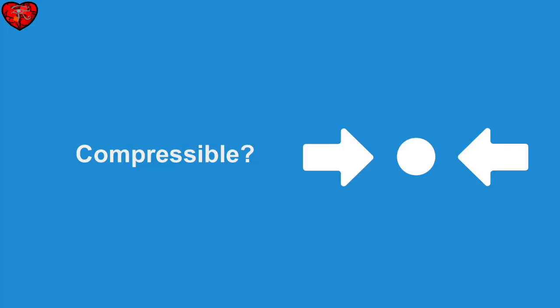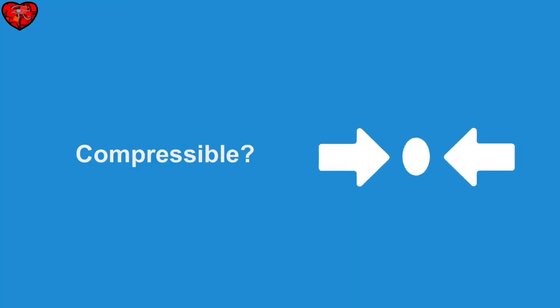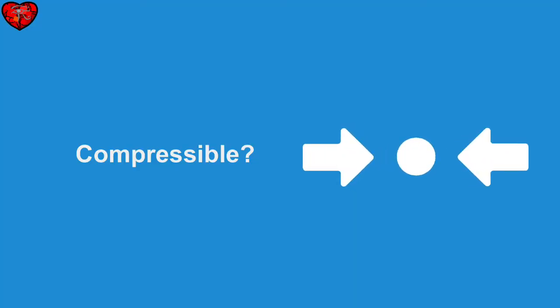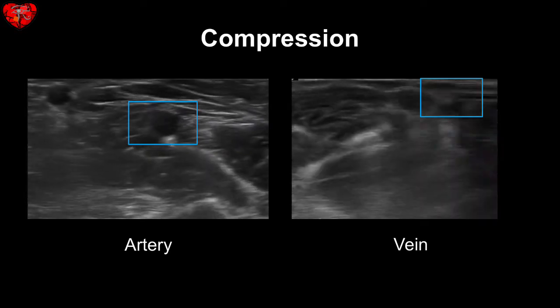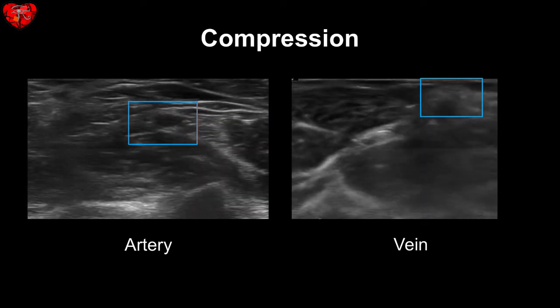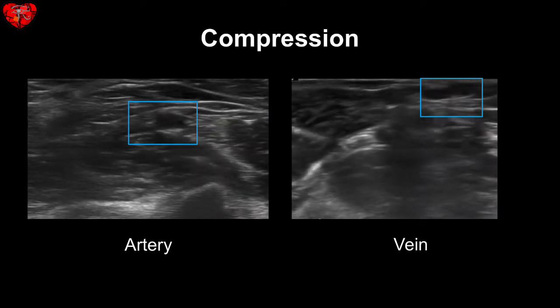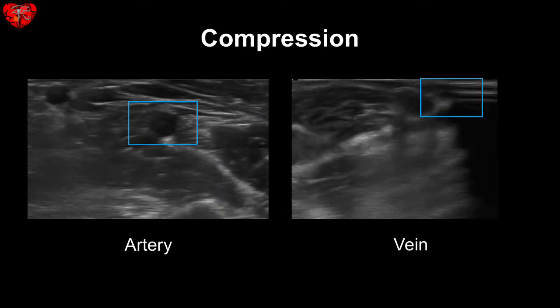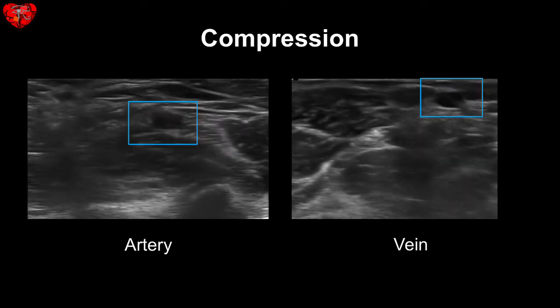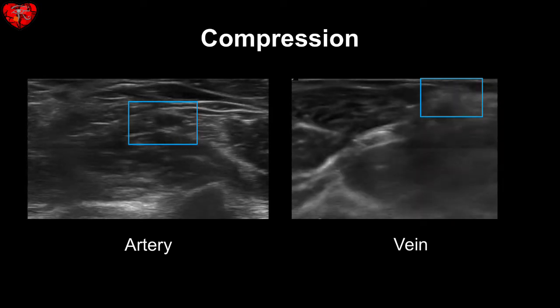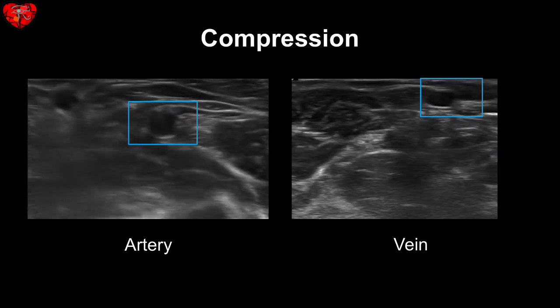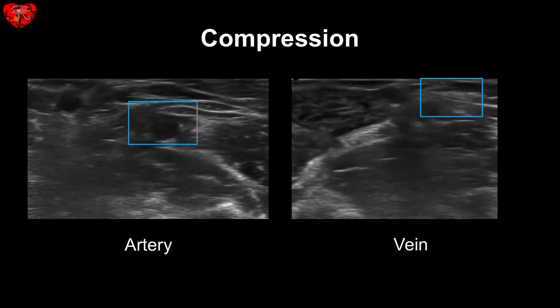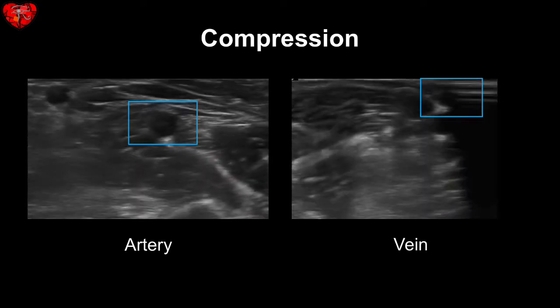Another way to tell the difference between an artery and a vein is to see if it's compressible. Here you can see the operator attempting to compress these two vessels. An artery will not compress completely with pressure — it may compress slightly, but not fully. A vein should completely compress unless there is a thrombus or other pathology present.